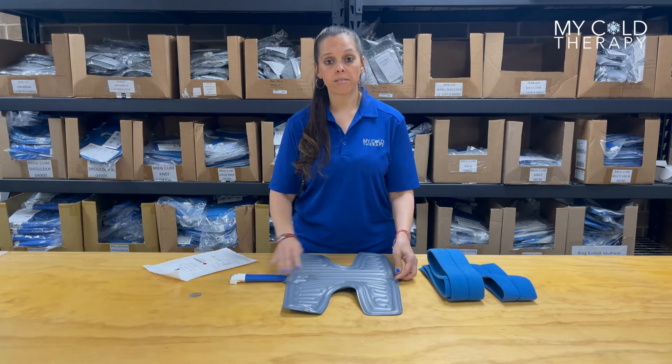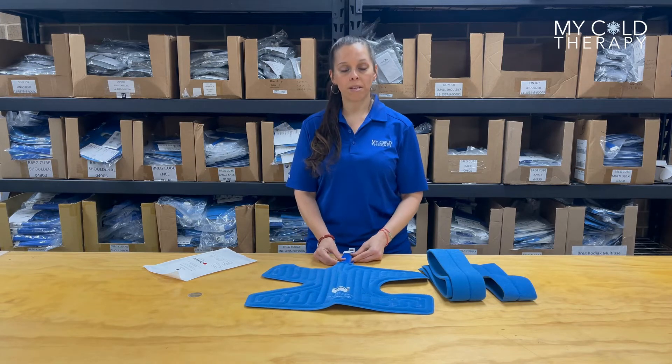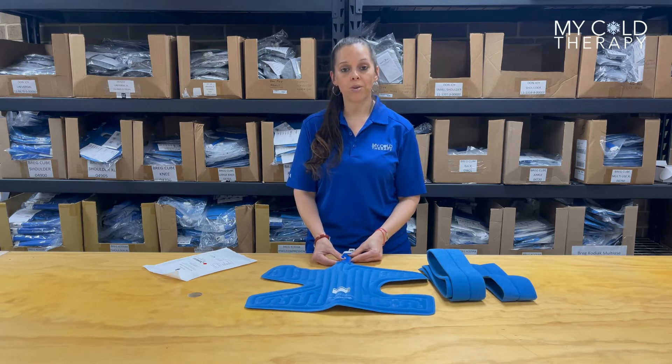For full specs on the Hip Pad, visit our website www.MyColdTherapy.com and click on the link for the Video Library. Now I'm going to show you how to apply the pad.